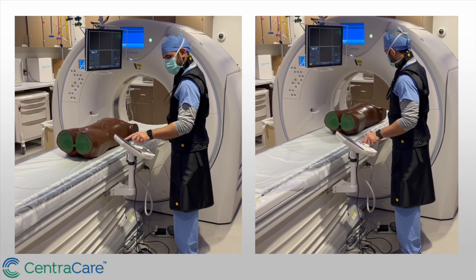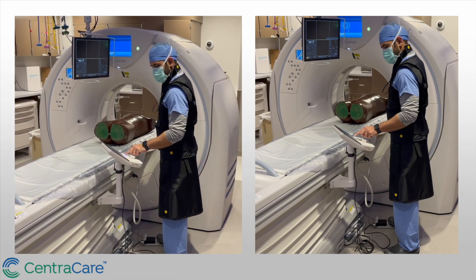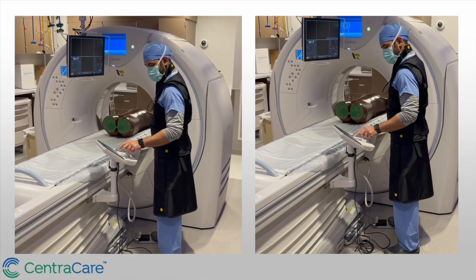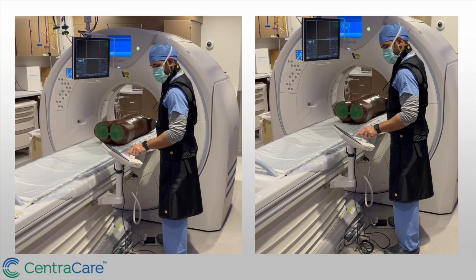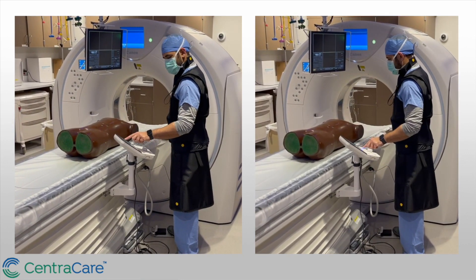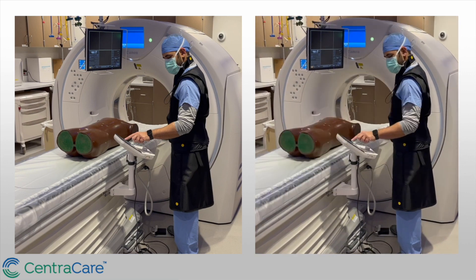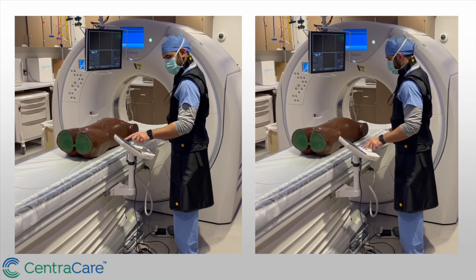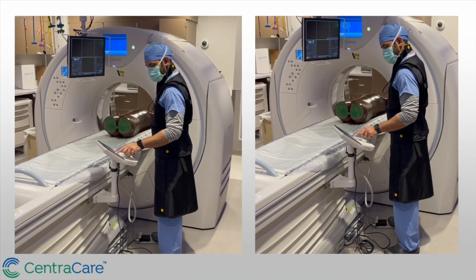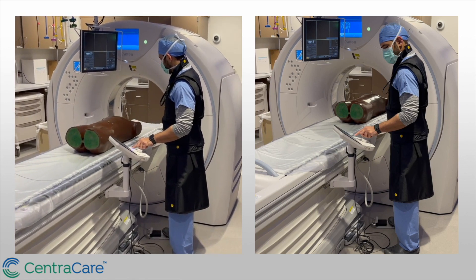The panel is attached to the couch and also plugs into the couch. There's also a foot pedal attached to the panel, which has a long cord with a lot of slack, so you can move the foot pedal to where you're standing. The panel can be hooked up to either side of the couch, so it doesn't matter if you're standing on the right or the left of the patient. My procedure tray is usually in front of the panel, so I hardly have to turn around at all during procedures — not even to window the images, angle the gantry, or move the couch.